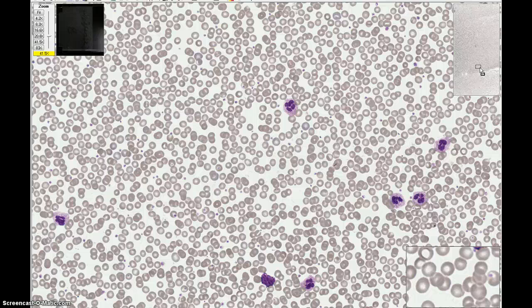Remember to look for distinguishing features in the cells that will help with identification. Consider the three features of the cells: the nucleus, the cytoplasm, and the granules. You'll want to think of each of these three features in terms of their color, character, and amount.